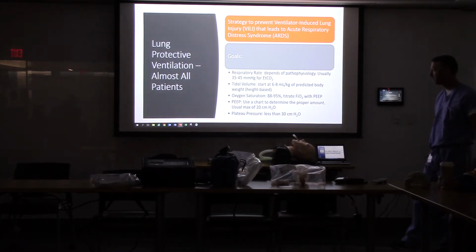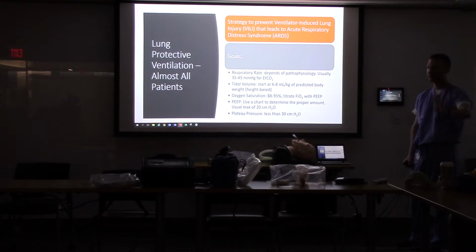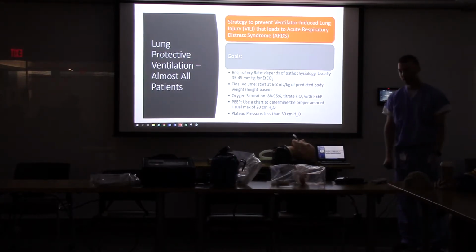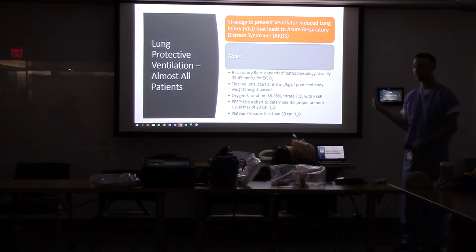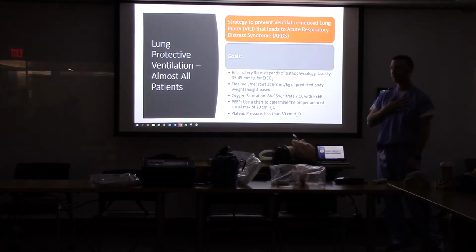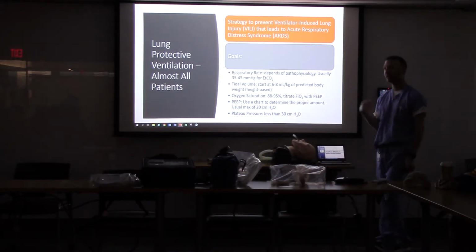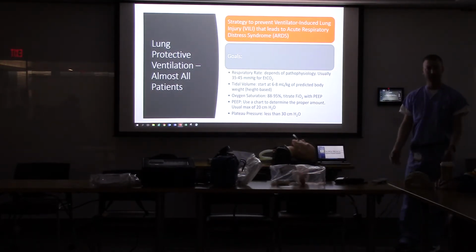So now, what's called lung protective ventilation. Back in the pre-2000s, people would get set with tidal volumes of 10 to 15 milliliters per kilogram of weight for each breath. So if I weigh 70 kilos, they would give me 700 to 1,000 per breath. And they were seeing that over periods of days to weeks to months of ventilation, people would get injured lungs, they would never come off the ventilator and whatnot.